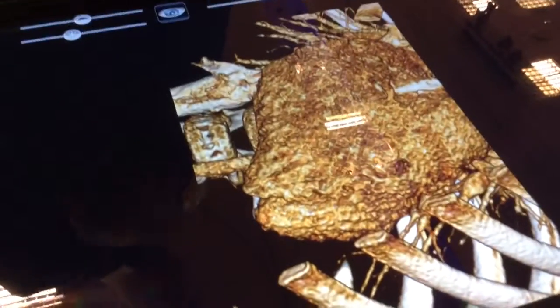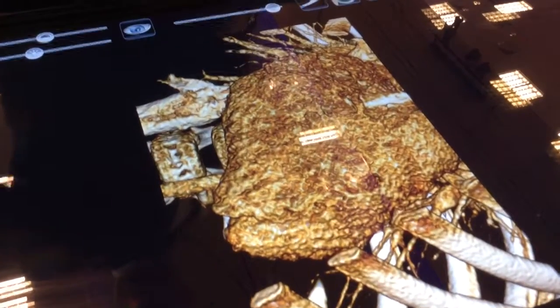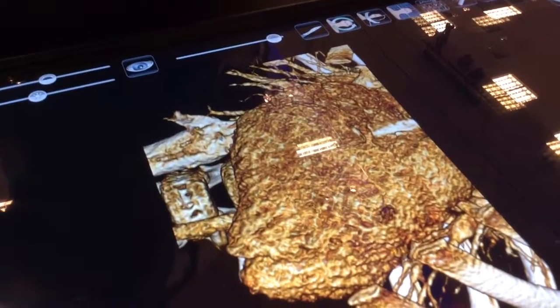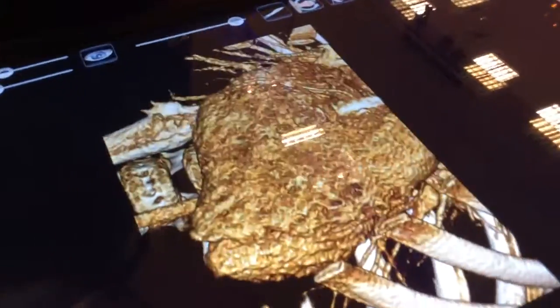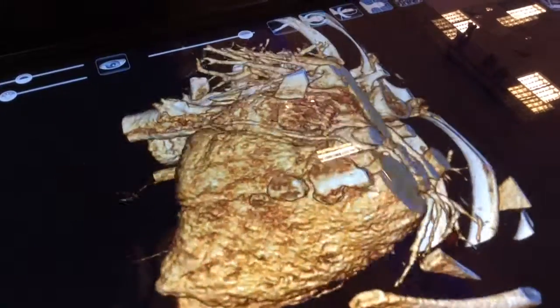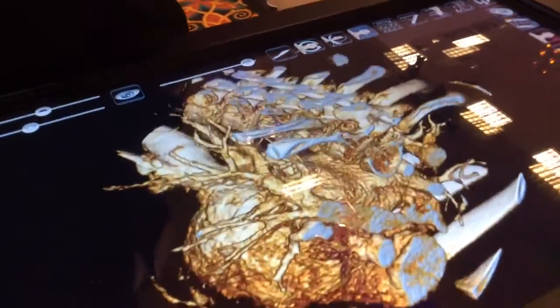So here, this is actually our 4D heart. 4D heart. Okay. We call it 4D because there's a time component here. Now I'll be honest, the image of that right now doesn't look very good to me. Well, it is a CT scan, so you can't see extremely fine structures. It looks like a heart that's been dipped in acid or something. It's full of pockmarks. Yeah, you can only do so much with CT data, but here we can see it beat in real time. I was going to ask, so it's actually beating in real time. That's cool.